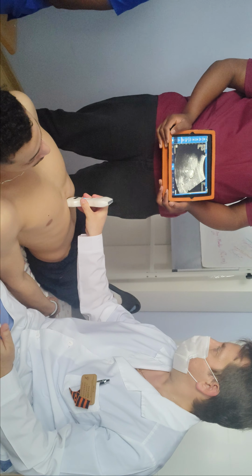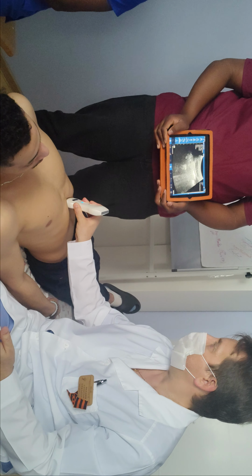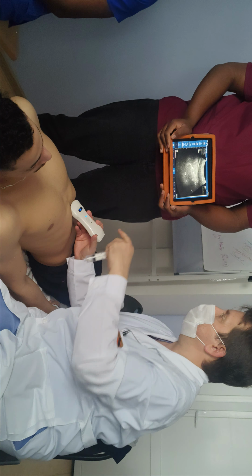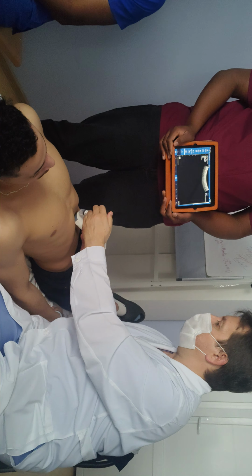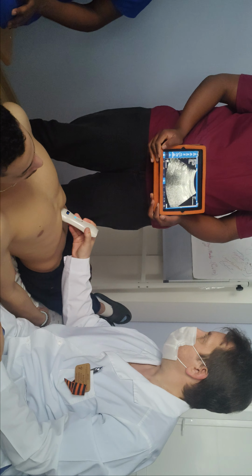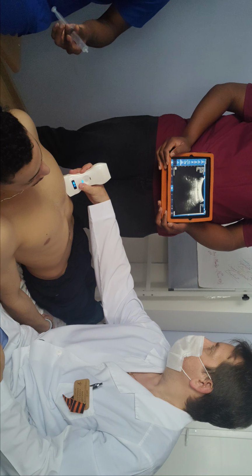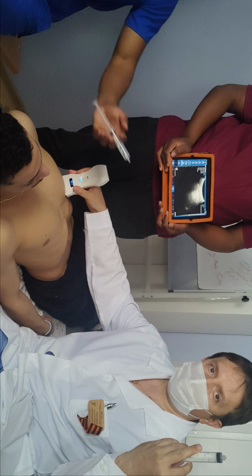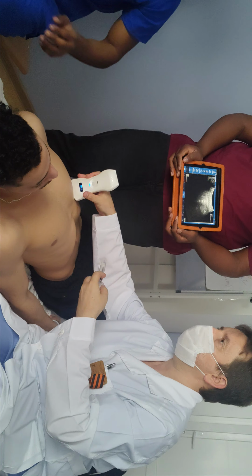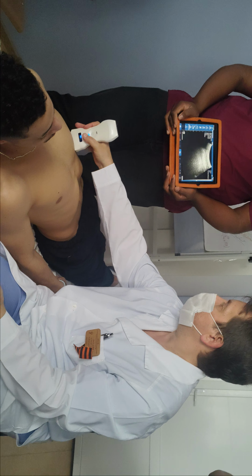the heart beating part. It is a hepatic zone. If we cannot reach through that point of view, actually we may, you see, it is a beating heart. But in some cases, it's not very good to pass through that direction for us. Then we slide just here. Actually, our purpose is to find the pericardium. Why do we need several syringes? Because we empty them one by one, and it may take a lot of water. But it's easy to remove. That's why it's better in comparison with the gel.